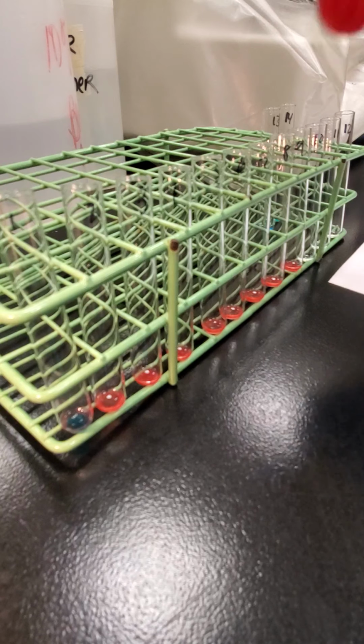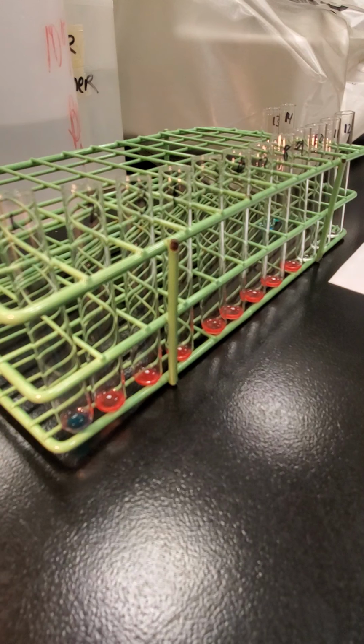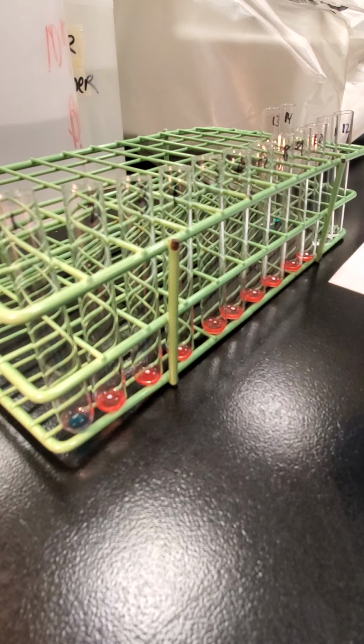So this is testing our screen. So I'm going to add screen cell 1 to 10 and 13. And the reasons for all this testing is also outlined on the interpretation of the QC results. So it tells you why we do all of this.